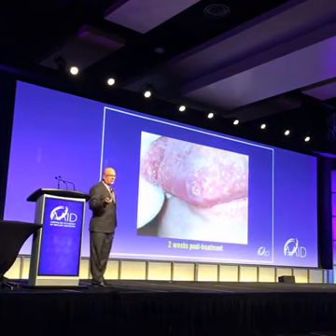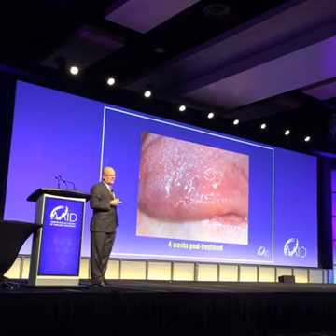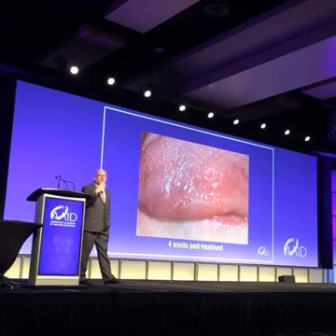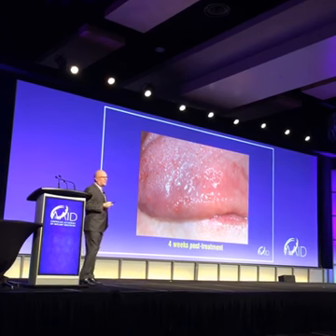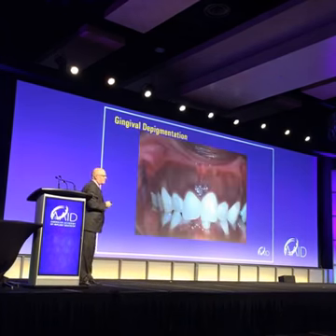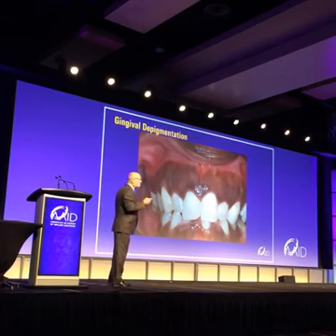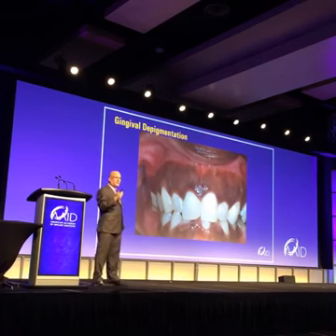Two weeks later, that's what it looks like. Four weeks later, that's what it looks like. No char, no bleeding, very simple, but using laser physics and where interaction happens, we can do things like this. Or we can do things like this, gingival depigmentation. Very nice, this patient came in, wanted this to look better.